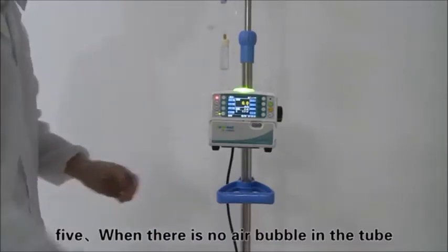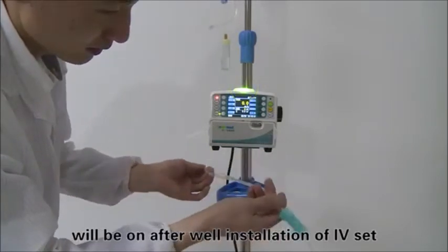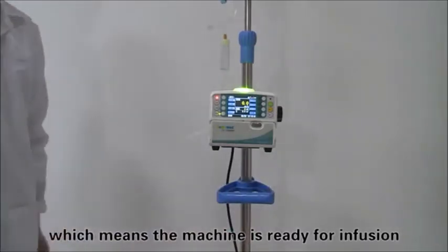When there is no air bubble in the tube, the green indicator light will turn on after correct installation of the IV set, which means the machine is ready for infusion.